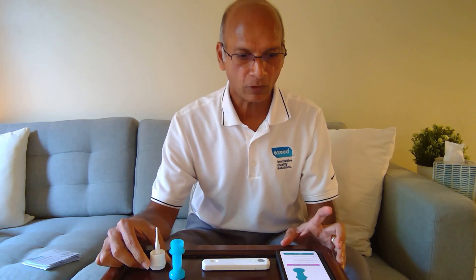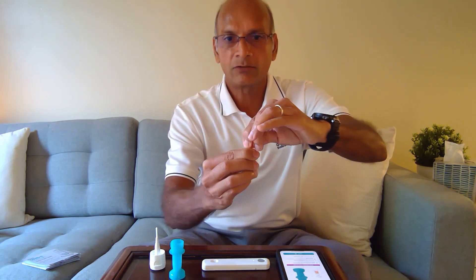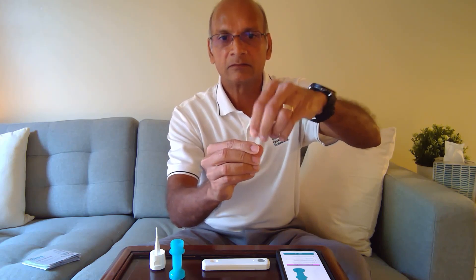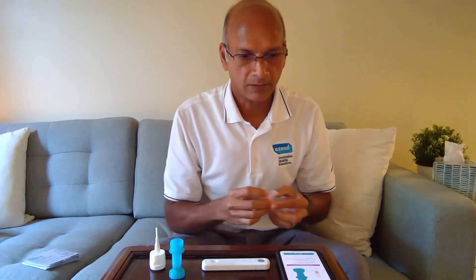Twist and pull the tab of the processing fluid container. So we're going to twist this tab — make sure not to spill any liquid. Then we're going to drop it inside the dropper by squeezing it. Make sure you don't spill it anywhere. So we have done that. Now we have removed the child adapter.